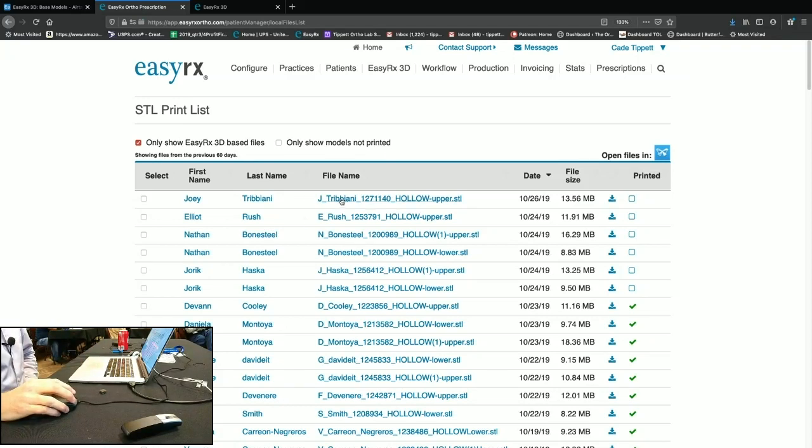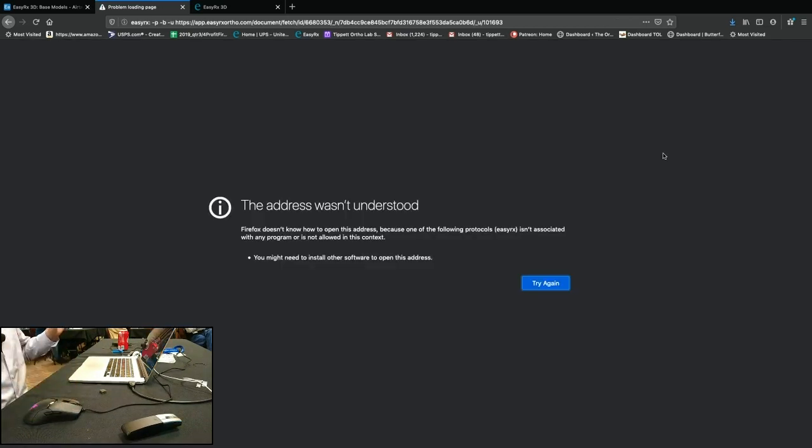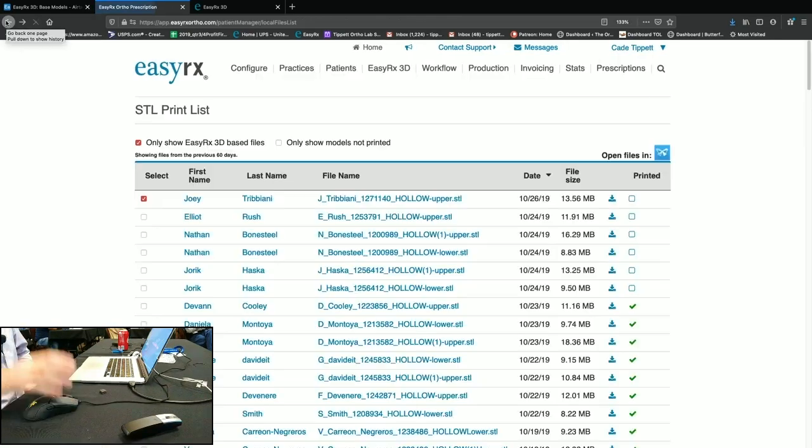So then these are all the files. There's Joey Tribbiani. I select that. And if I click here, it's not going to do anything because it gives an error. But on my PC, it will go and open Preform. So that's why I took that video, so you can see it pull that out of the script and throw it onto the Preform software.